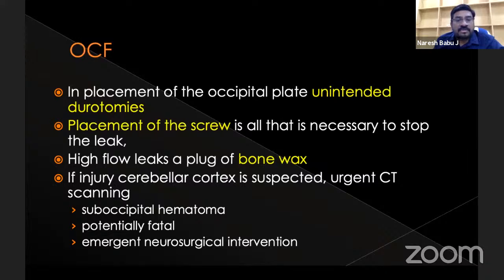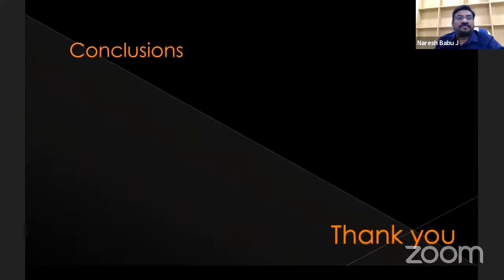This can lead to suboccipital hematoma, and that can be potentially fatal. And emergent neurosurgical intervention has to be done. With a longer screw, hitting the cerebellar cortex is a dangerous sign while putting an occipital screw.